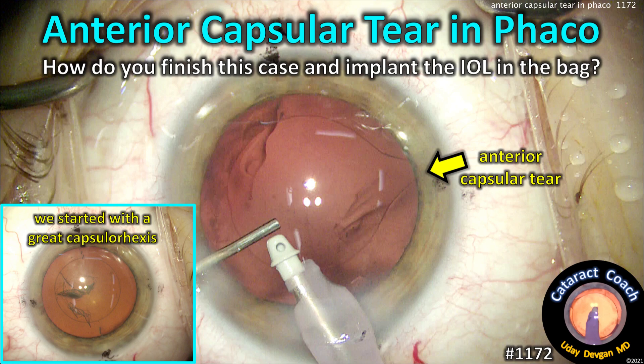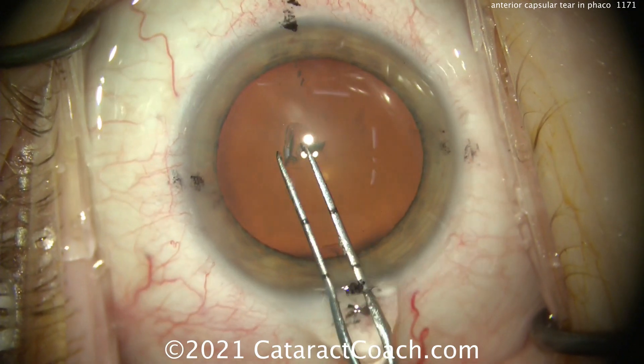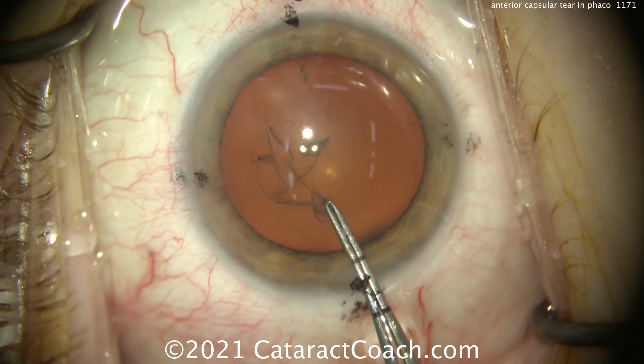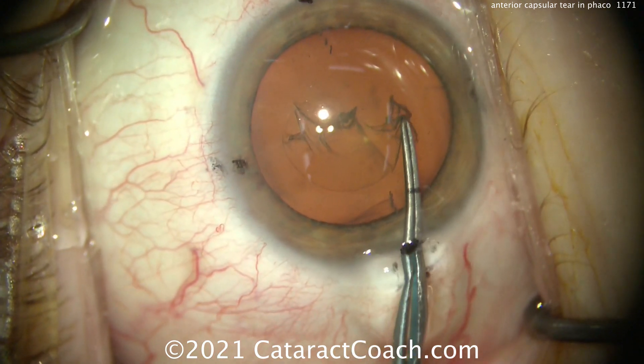CataractCoach.com. Anterior Capsular Tear — Faco. So how do you finish the case and implant the IOL in the bag? Here's the beginning of the surgery. Look at the cornea — we've got those marks at the 180 degree meridian, close to it. That's the steep axis, and that means we're going to be putting in a toric IOL. In fact, it's a toric trifocal lens.